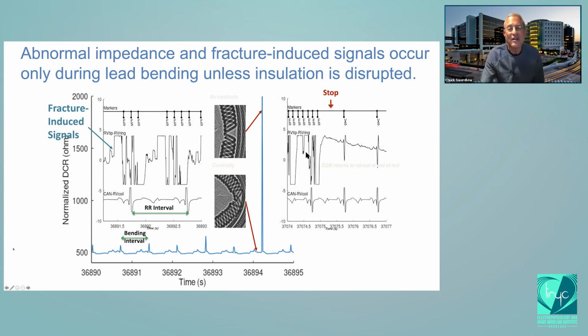So diagnosing conductor fractures can be pretty tricky, and we can have complete breaks with next to no impedance changes. So this is one of the reasons that Dr. Pelot, Dr. Bordechar, and Dr. Strick have written a number of papers emphasizing the importance of reviewing the electrograms, even just random electrograms that come through on routine transmissions, to make sure that leads aren't fractured, even though the impedances are normal.